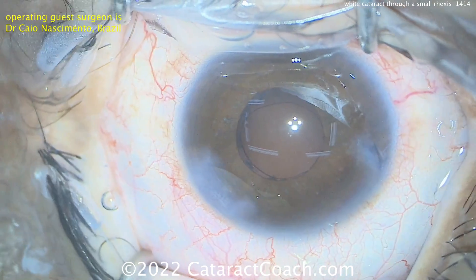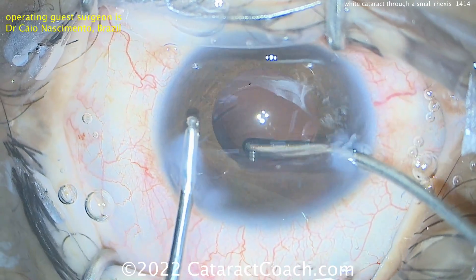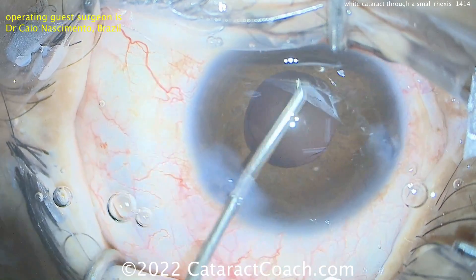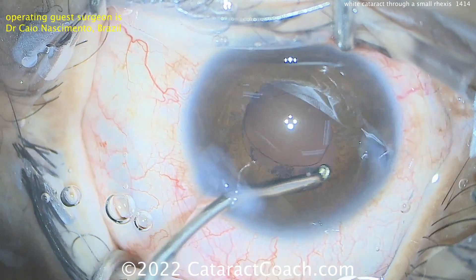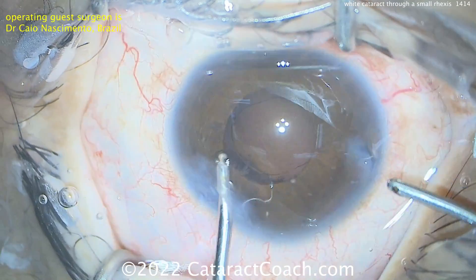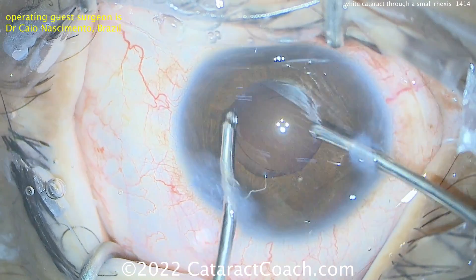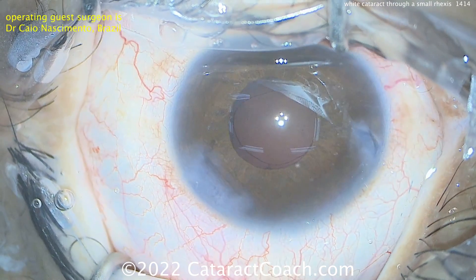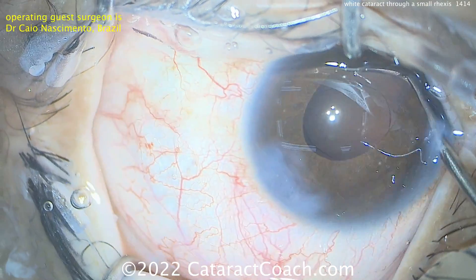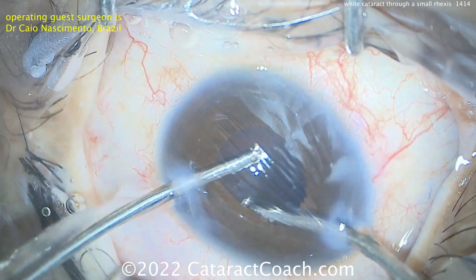The capsular bag looks pretty much cleaned up. We're going to go bimanual cortex removal here with bimanual I/A. You can see the infusion is going into the main incision — if you're careful enough to float in that incision, you don't actually need a second paracentesis. Now just using that infusion to squirt around a little bit more, and now the aspirator goes in the right hand underneath the capsule edge into the capsular bag equator. Hands being switched now — infusion in the right hand, aspirator in the left hand.